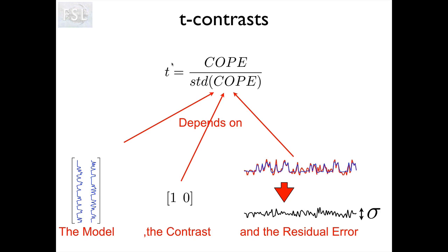And if you know the t-statistic, you know that if you have a lot of measurements, then the t-statistic goes up, i.e. you are more confident in your statistical values. So a model which is a long time series would increase the t-value, whereas a model that is a short time series, a very short experiment, would decrease our t-value.